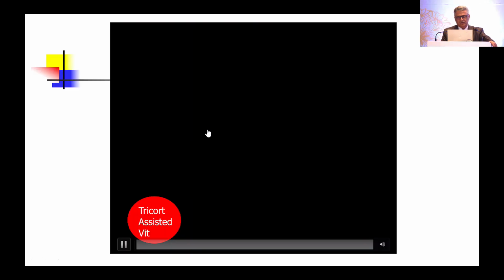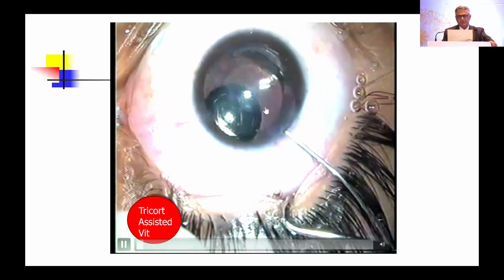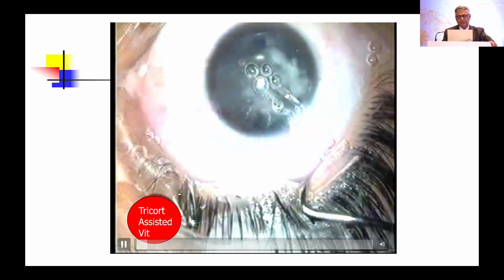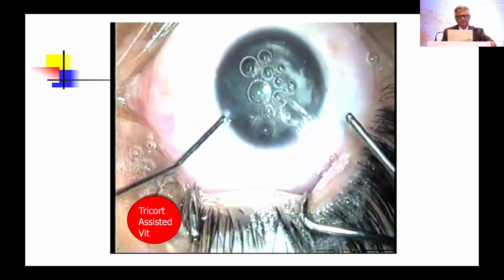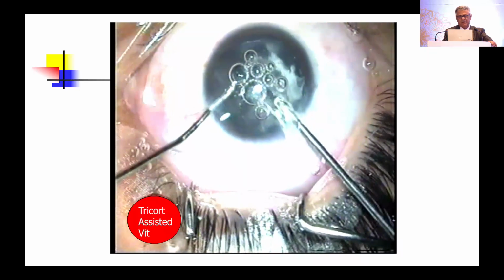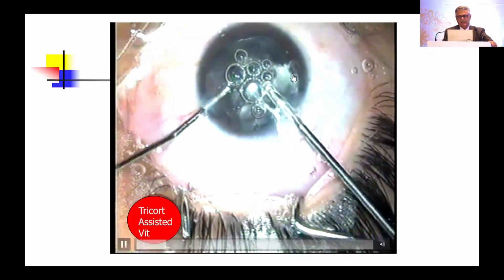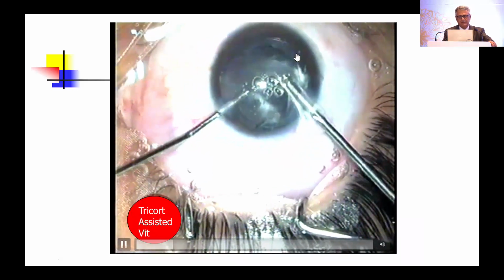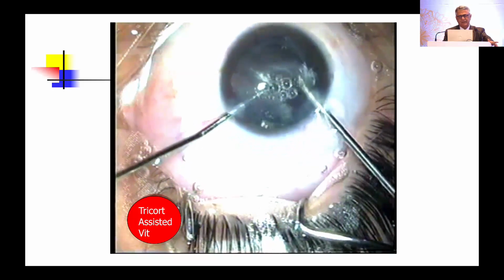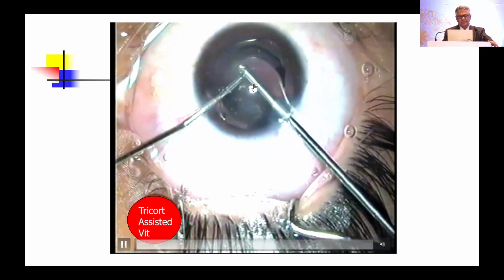Another video of another surgeon actually. You see here there is some air bubble here. So this is a nicer thing. At least after that PCR he has bothered to put triamcinolone inside. And triamcinolone has the property to get adsorbed onto the vitreous fibrils so that they are seen. And now it is definite. You see all this vitreous here. So this is being cut.